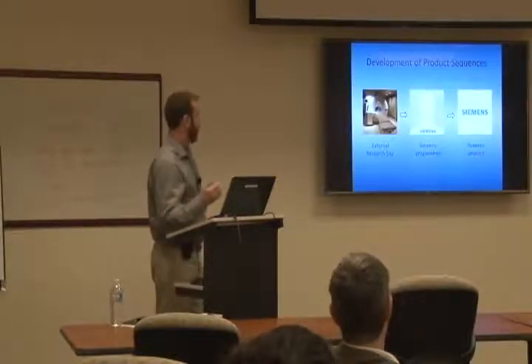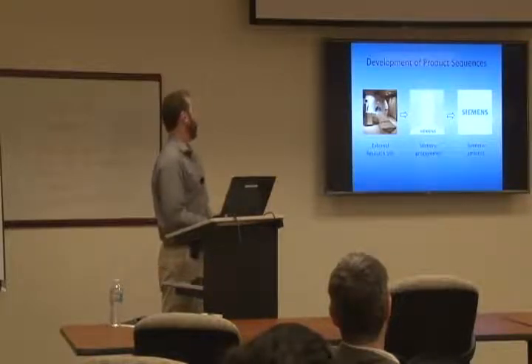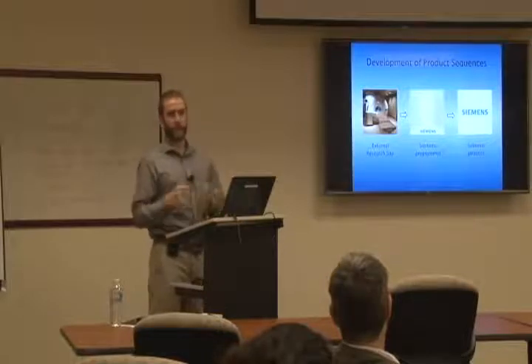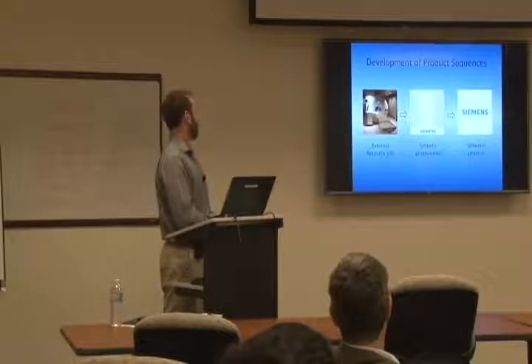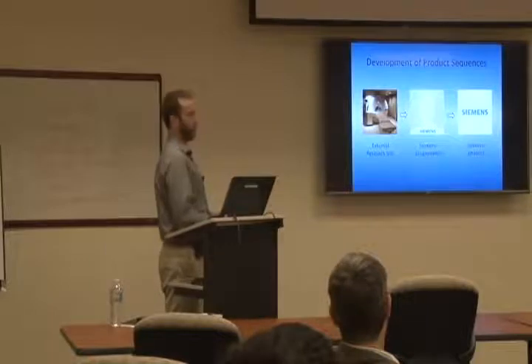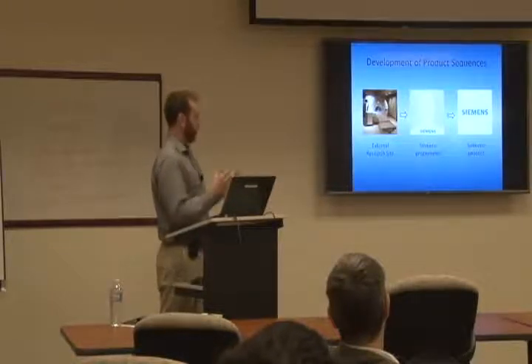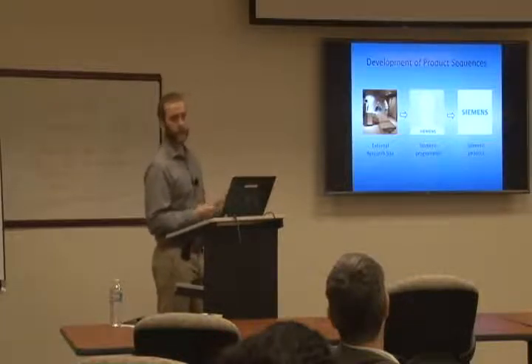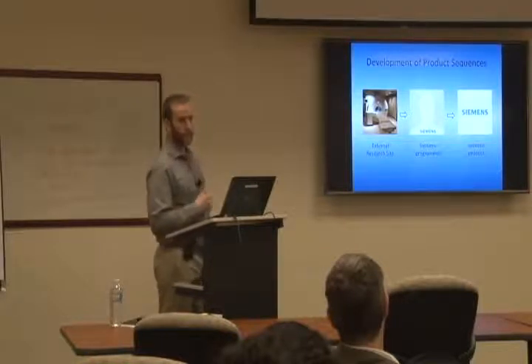But so this is the pipeline for sequences that are coming out. You have an external research site. They develop their sequence and their protocol for it, and they present it in papers. They present it at conferences. You get a lot of buzz around it. People are requesting the sequence from them, and manufacturers like Siemens, they're going to hear about this buzz, and they're going to be like, okay, well, we want this sequence on our scanner. So they're going to assign a programmer to it. It's going to become the programmer's baby.